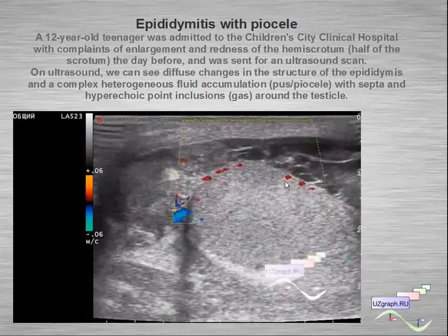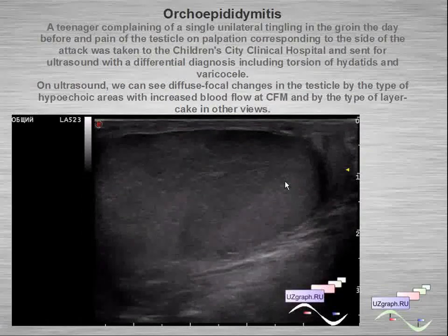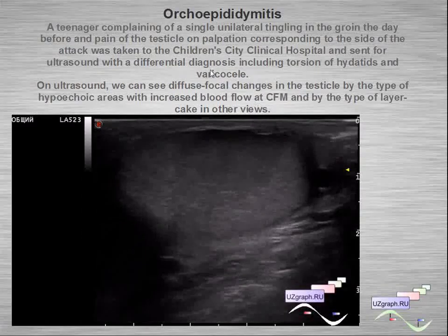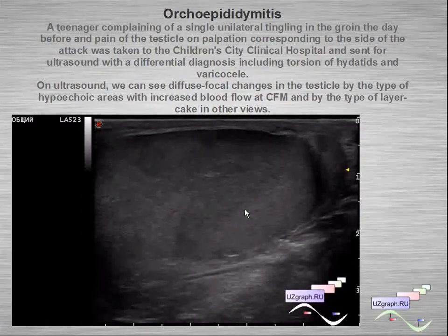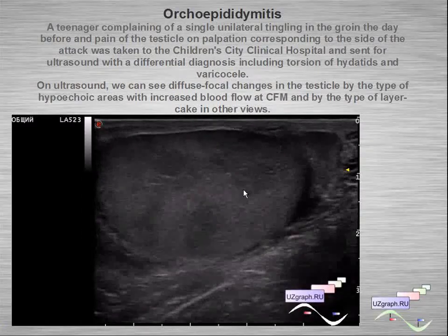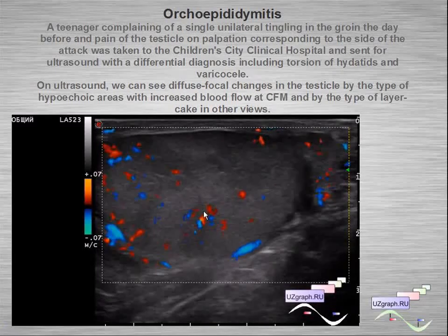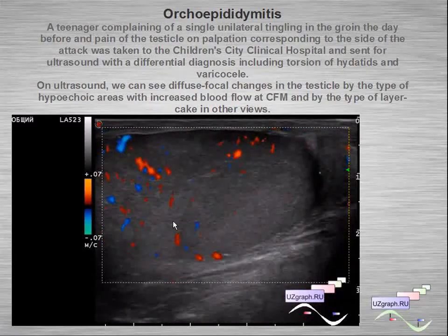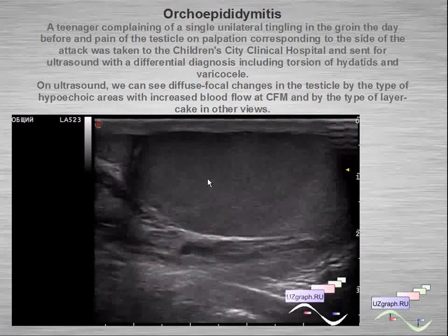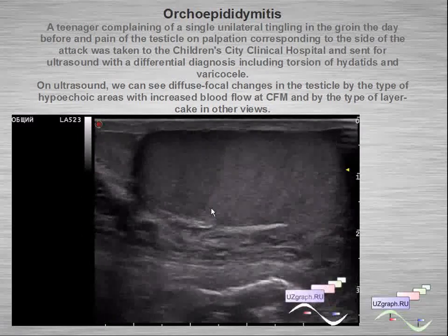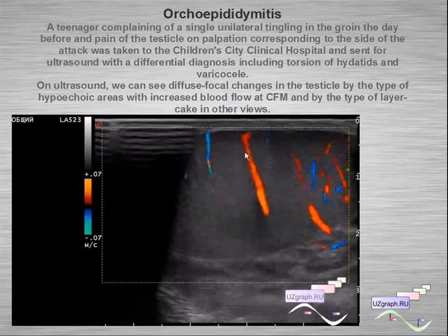In other examples of orchido-epididymitis, there is a hypoechoic area with increased blood flow at color flow mode. In some planes it looks like a layer cake.